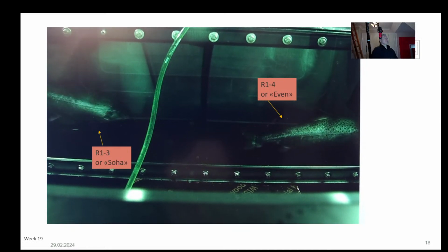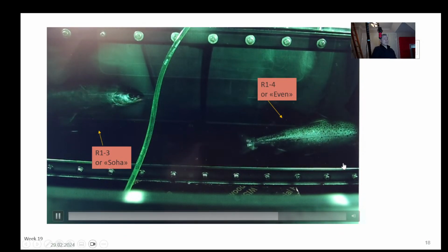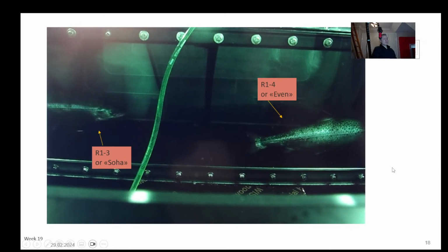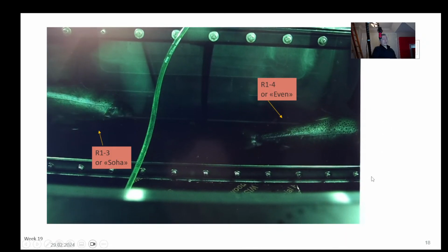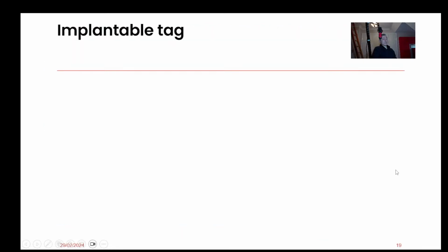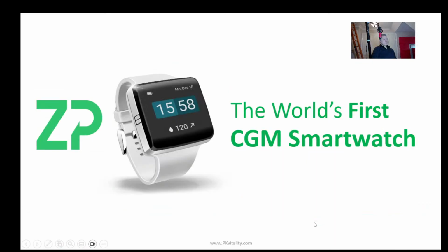I do understand that you can't put lithium-ion batteries into people. But if you take out the lithium-ion batteries and replace them with a telemetry charging source, since you can't put batteries or capacitors so much into people, I understand that. That said, we do have that technology stack, and we are getting glucose data out of fish, and we're now moving this into land animals as well. So we'll have fish and animal studies soon on this technology.